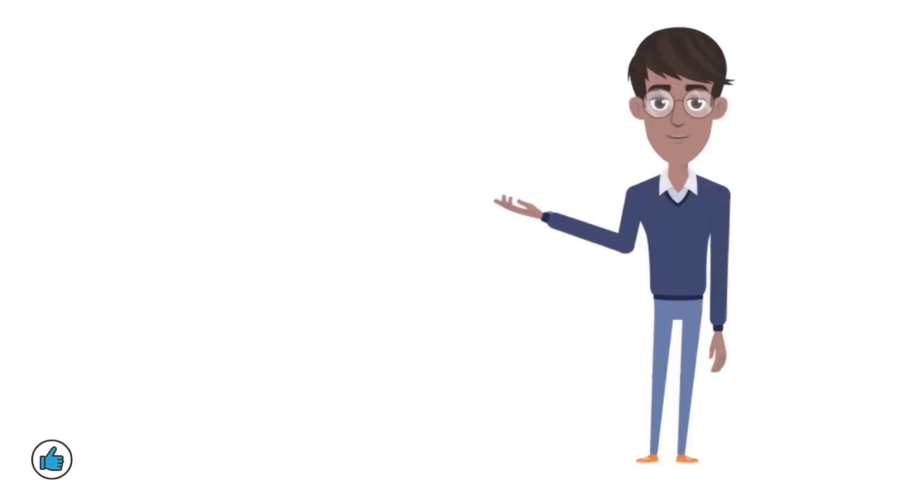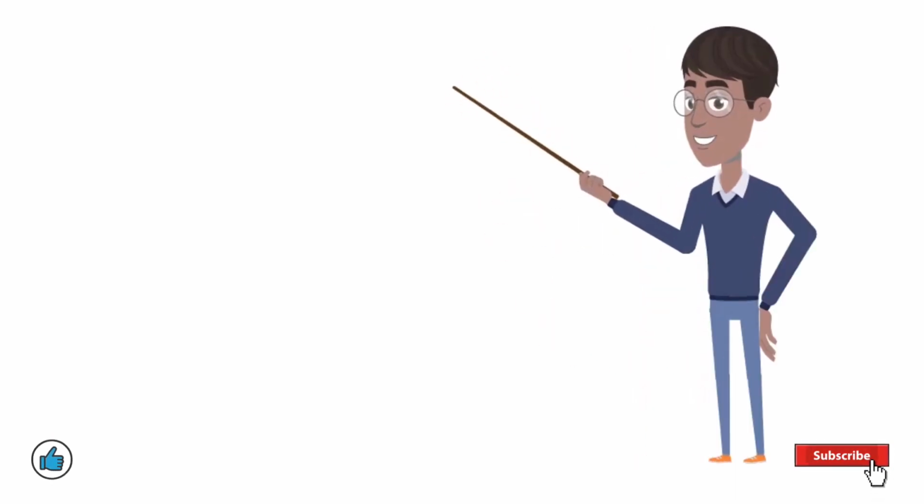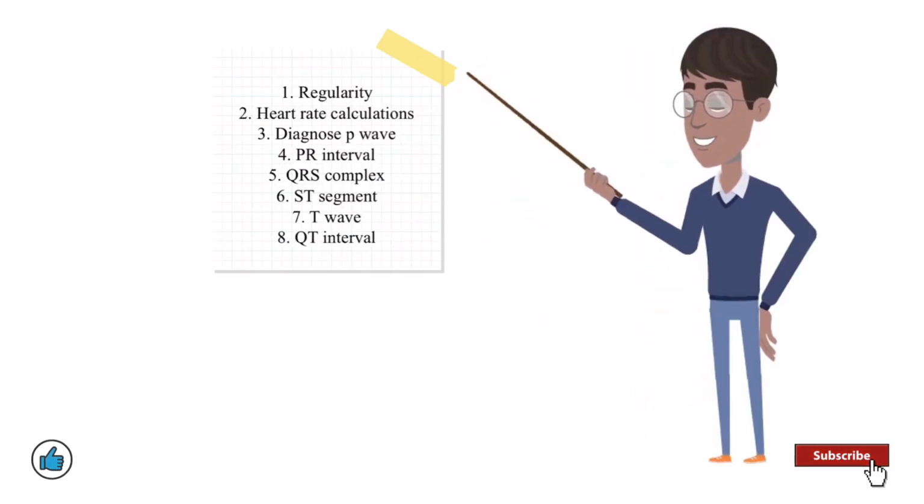Well done guys, we have come to the end of this session. For emphasis and summary, try and follow these steps displayed on your screen when next you are reading an ECG. Make sure you do this religiously.